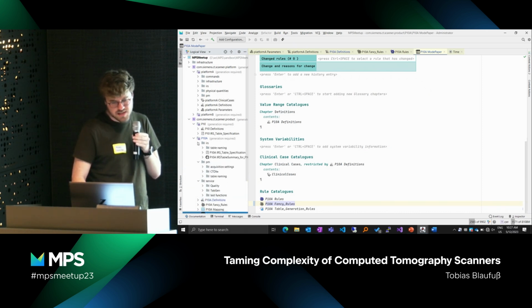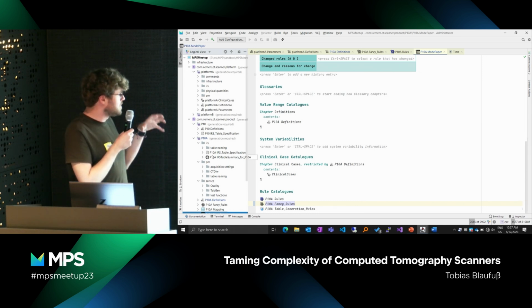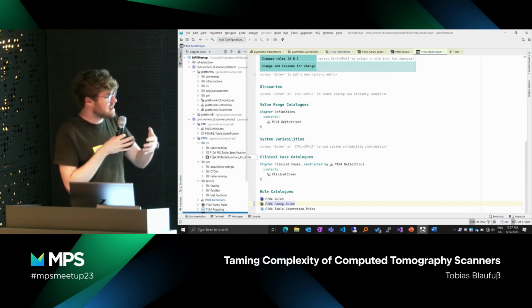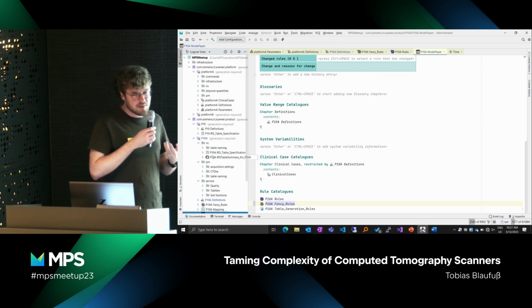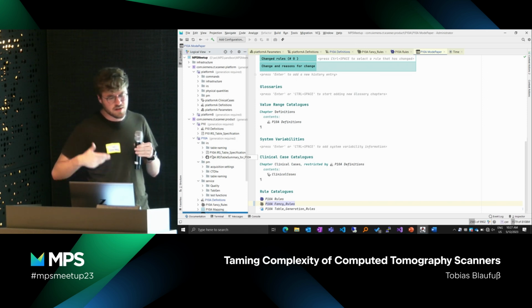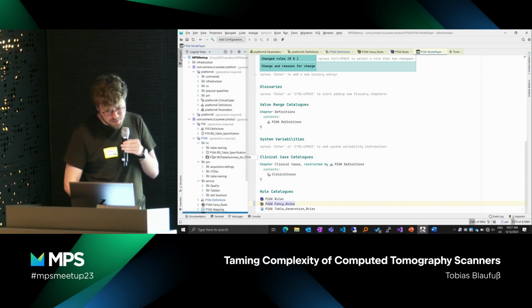But I can't go into detail here. We implemented a framework where we can map each parameter and value to a specific name that is used in that domain, because, as I said, they speak different languages, so we always have to map these values to the expected output.